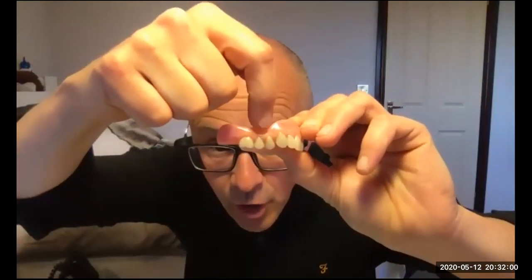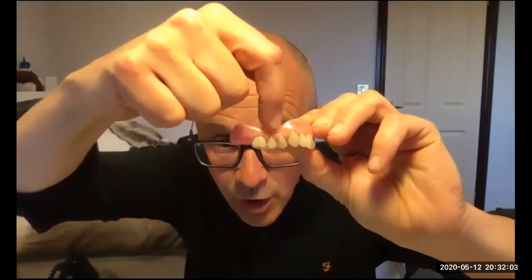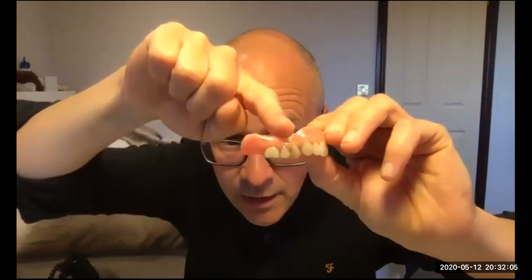that often when we've got a patient with a high frenum, and if you can see this denture here, quite often this frenum, the buccal frenum, is almost at the level of the ridge itself. That means when the patient smiles, air can get in underneath the denture and cause the denture to drop. So an air leak can occur.